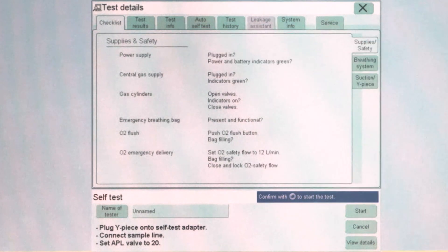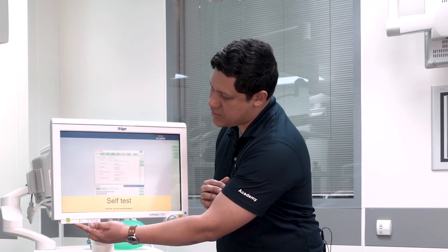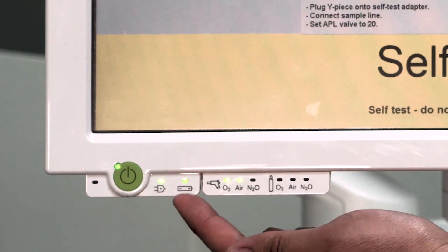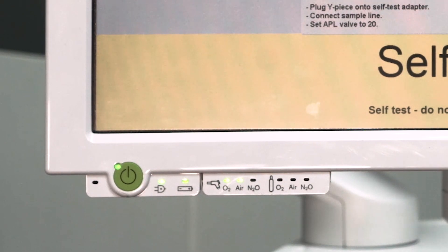In the first place, we have to make sure that there is power supply feeding the anesthesia device. We can verify this by the two small LEDs in the lower part of the display. This means that the anesthesia device is sourced by electricity and the internal backup battery is plugged and it is being charged.